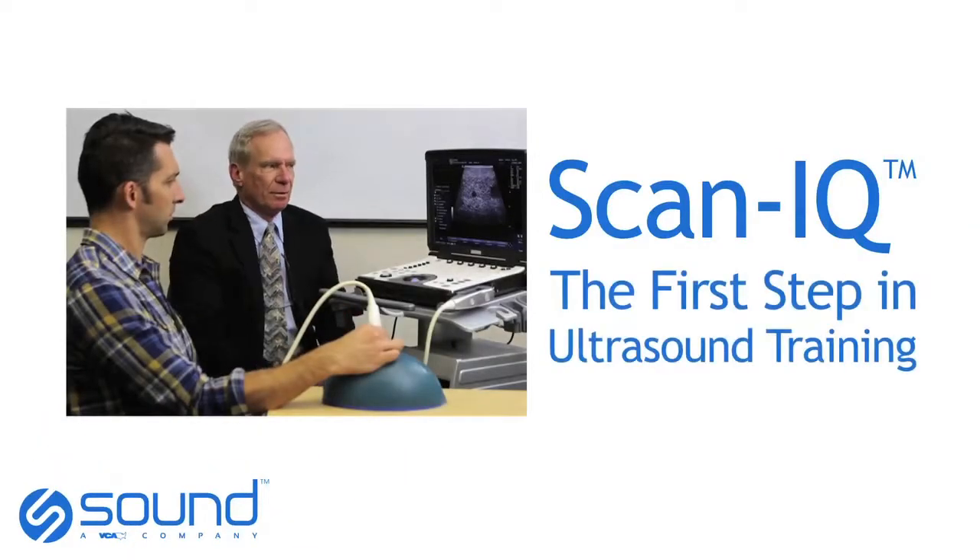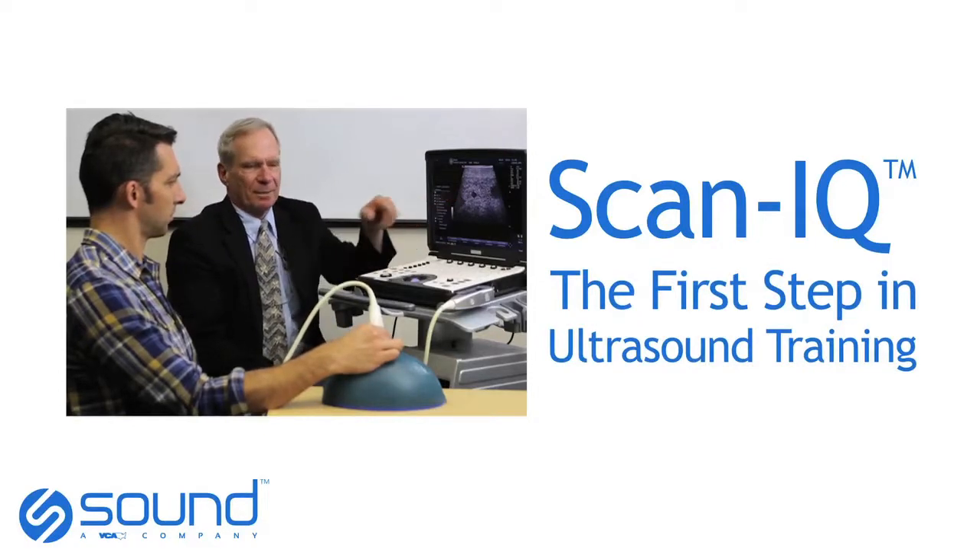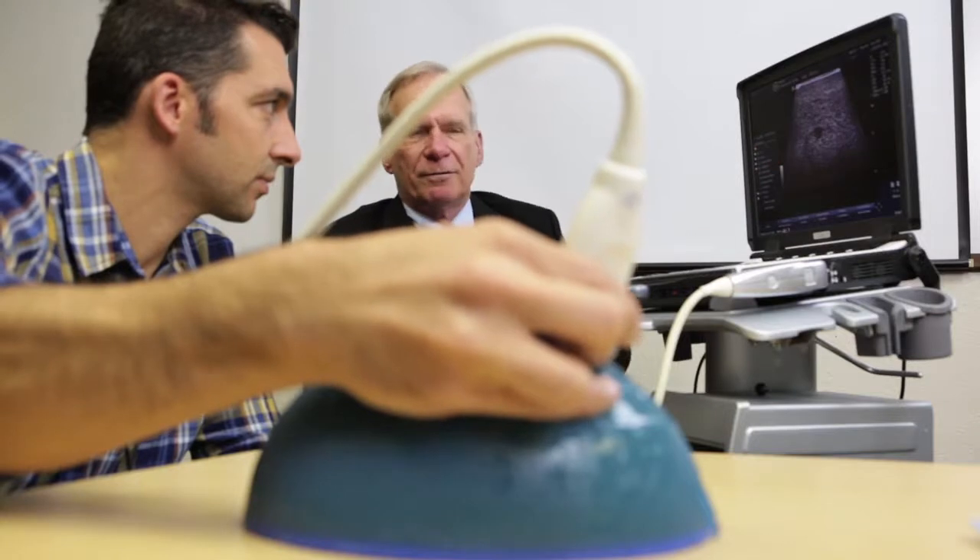Your transducer going across follows exactly the path of that object. That's it. Perfect. My thinking was if I can get somebody to have confidence in their control of the ultrasound beam, they're then prepared to continue to scan animals on their own with great success.